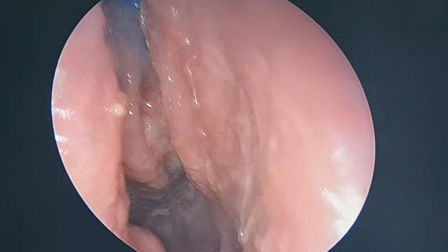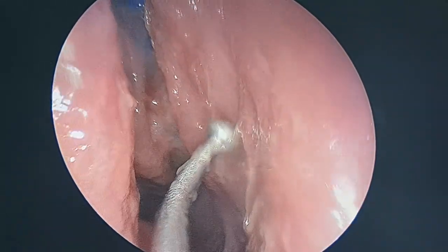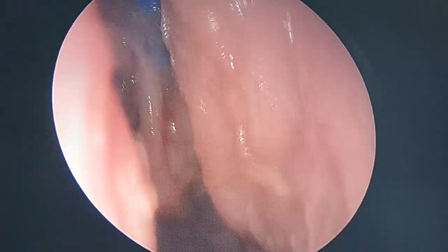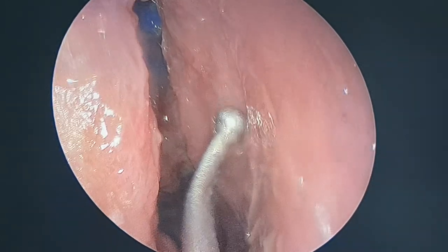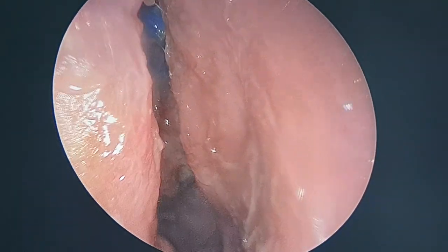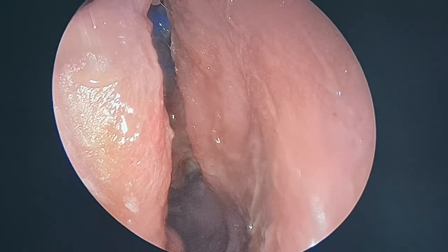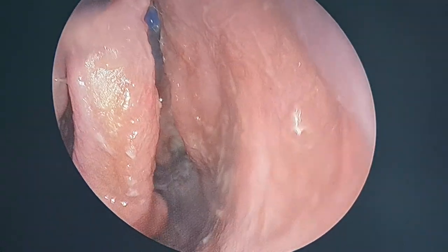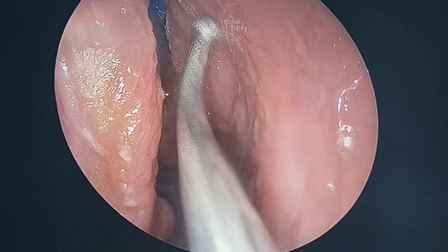Now, as I mentioned during the lecture, this uncinate has a close relationship with the orbit, particularly the upper part. And this is very, very important to extrapolate. This is a positive finding. You must extrapolate during your endoscopic dissection. The moment you remove the upper part of the uncinate, you get the lateral wall of the entire sinonasal corridor, that is the orbital wall, and that is the lamina papyracea.